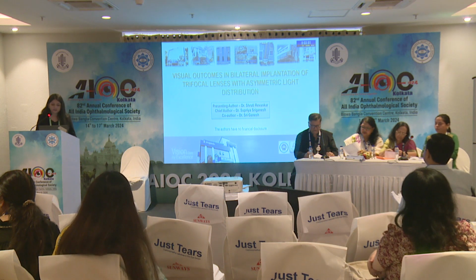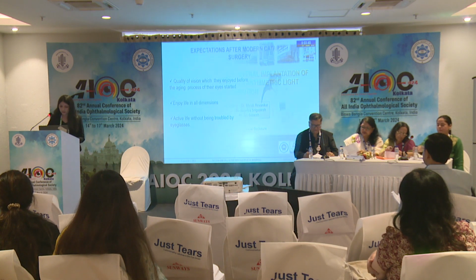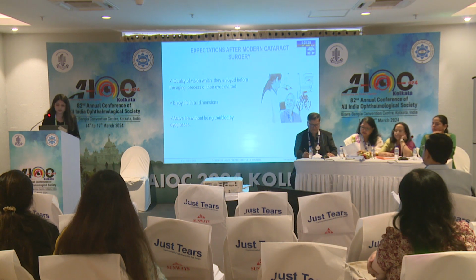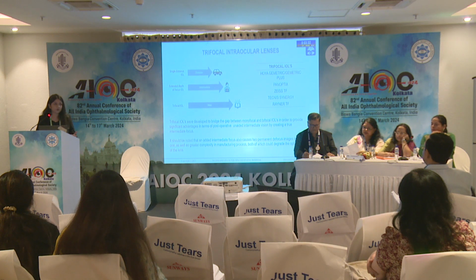I'm Dr. Shruti Revankar, and I'll be presenting the visual outcomes in bilateral implantation of trifocal lenses with asymmetric light distribution. We know that cataract surgery has evolved over time, and so have the patient's expectations. All want a quality of life which they enjoyed before the aging process of the eye started, and to have an active life without being troubled by the use of spectacles. So how do we promise this to the patients?